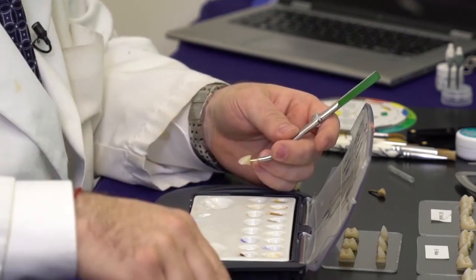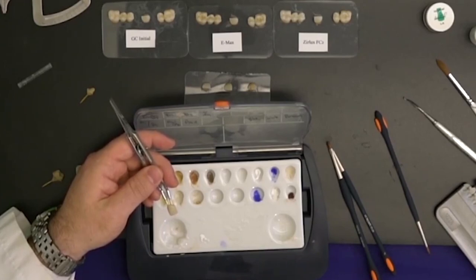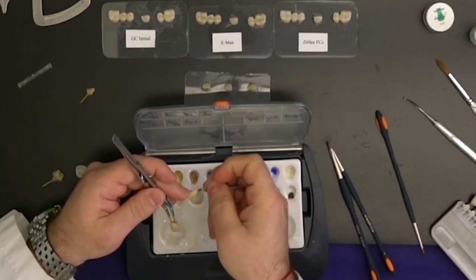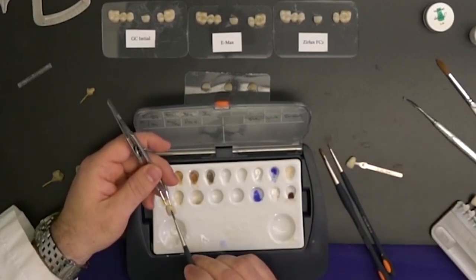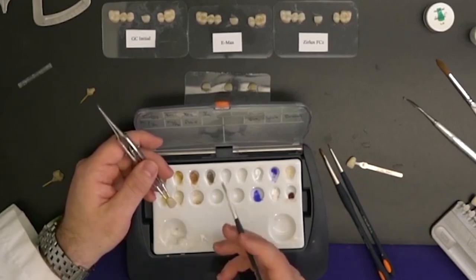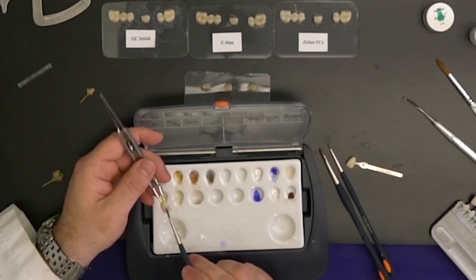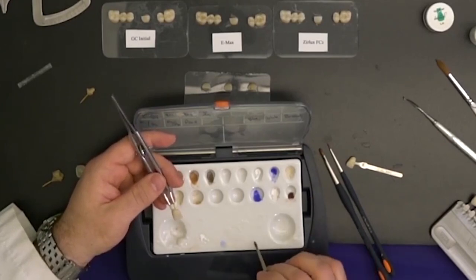Once I'm satisfied with the overall shade — which we can check against a shade guide — we can get fairly close to an A3 as you can see here. I can now go ahead and add a little bit where I feel it needs to tone down. In nature the height of contours are a little bit lighter, and right above the height of contour it's slightly more chromatic than at the height of contour itself, because that's the more polished area. You want to make it look blended as though it's always been there.